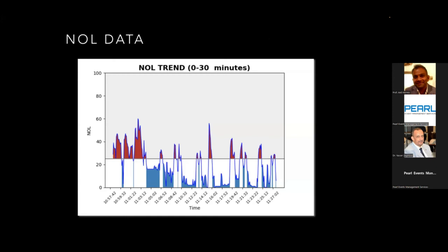So if we go and look at his NOL data, you can see this is where we put him to sleep. He was intubated here, which again shows a big spike. Again, he wasn't a difficult intubation, but it just shows how stimulating intubation can be. I placed the supraclavicular nerve block at this point here, 11:05 in the morning. He was positioned into beach chair, and at this stage, the surgeons wanted to do an EUA of his arm to see how mobile the fracture site was.